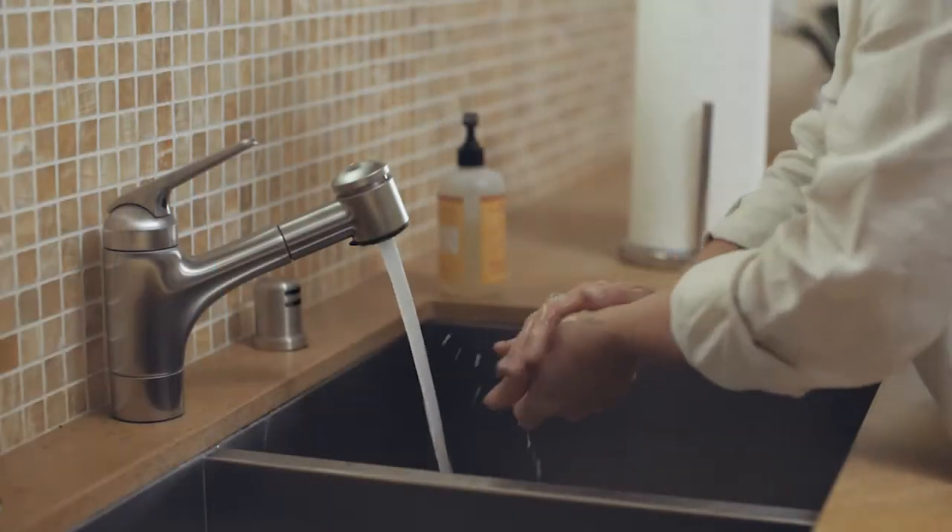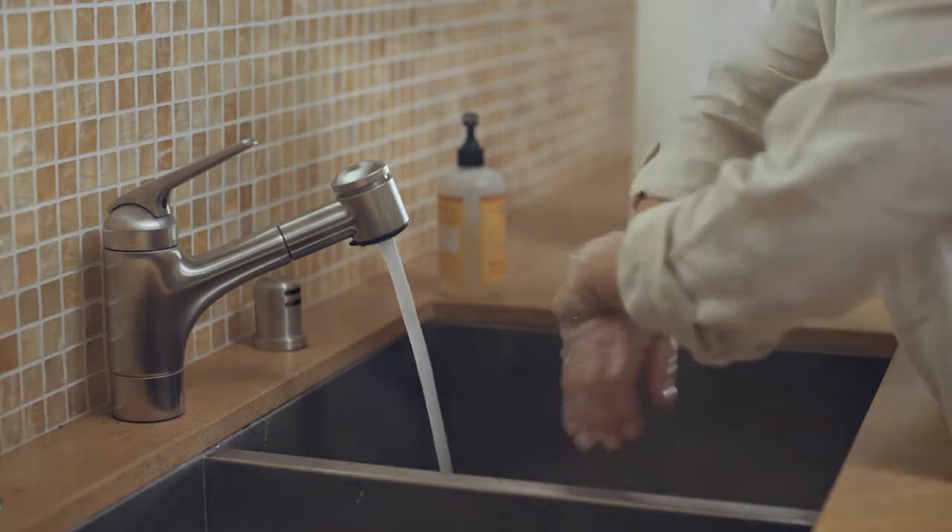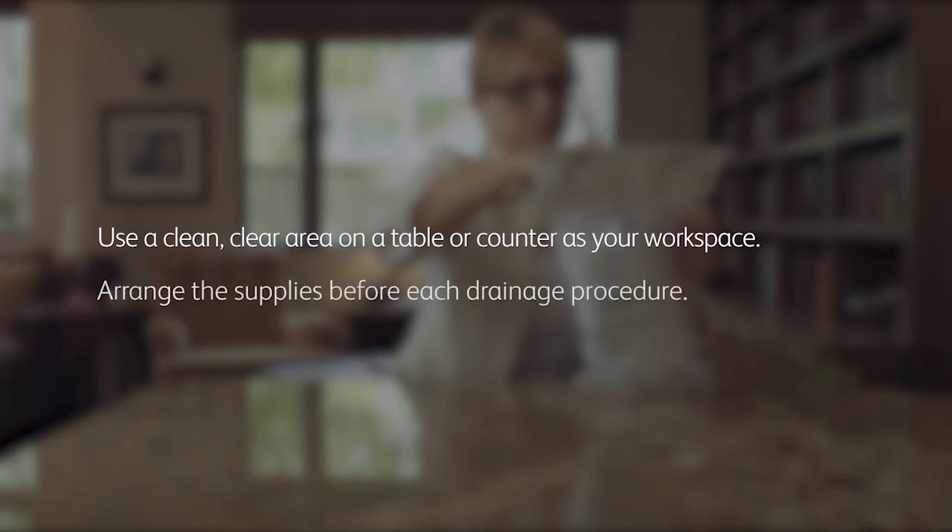After you've removed the dressing, wash your hands thoroughly with soap and water again for a full minute. Make sure you have a clean, clear area on a table or counter to serve as your workspace. You will want to arrange all of the supplies prior to beginning each drainage procedure.